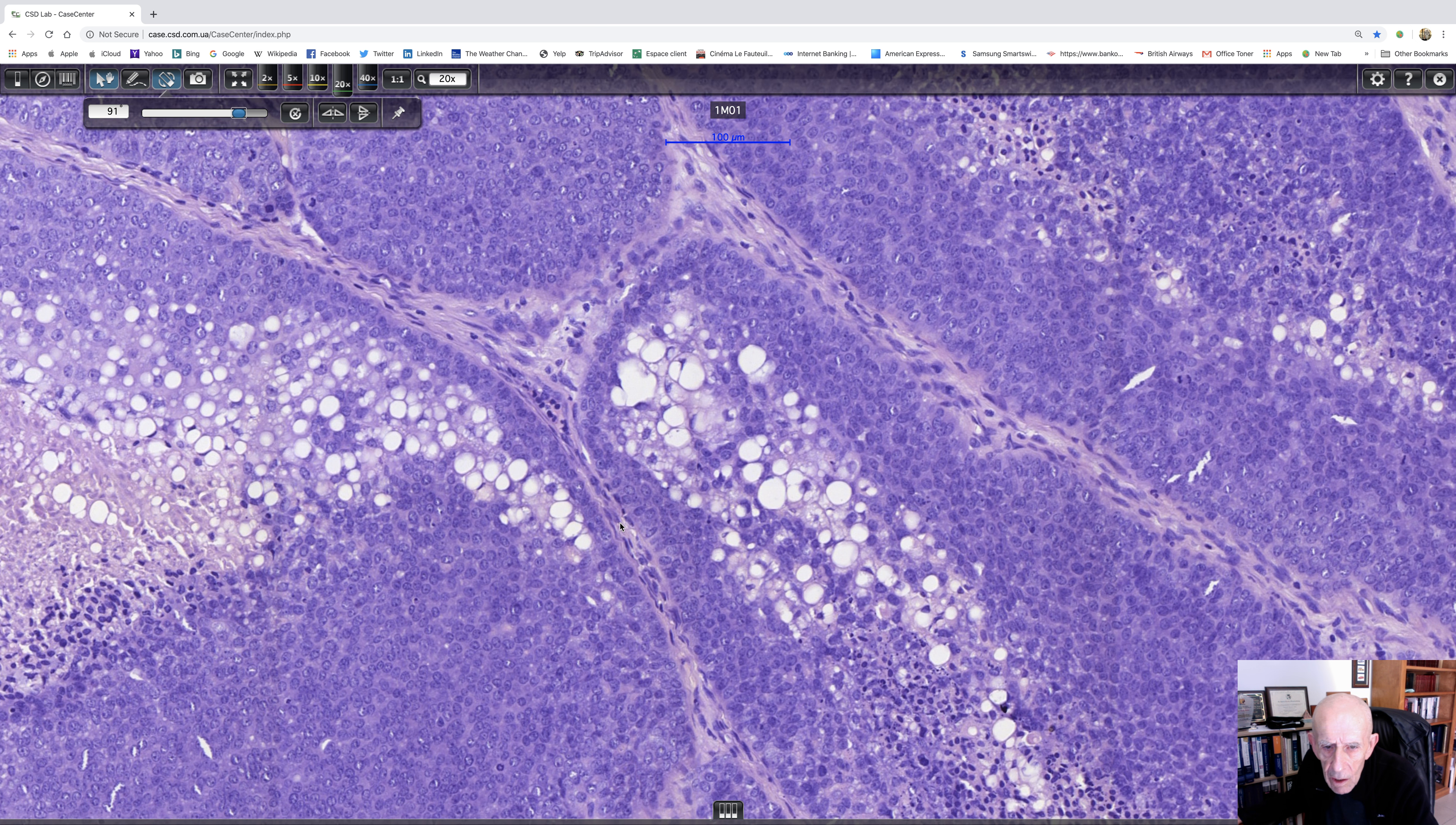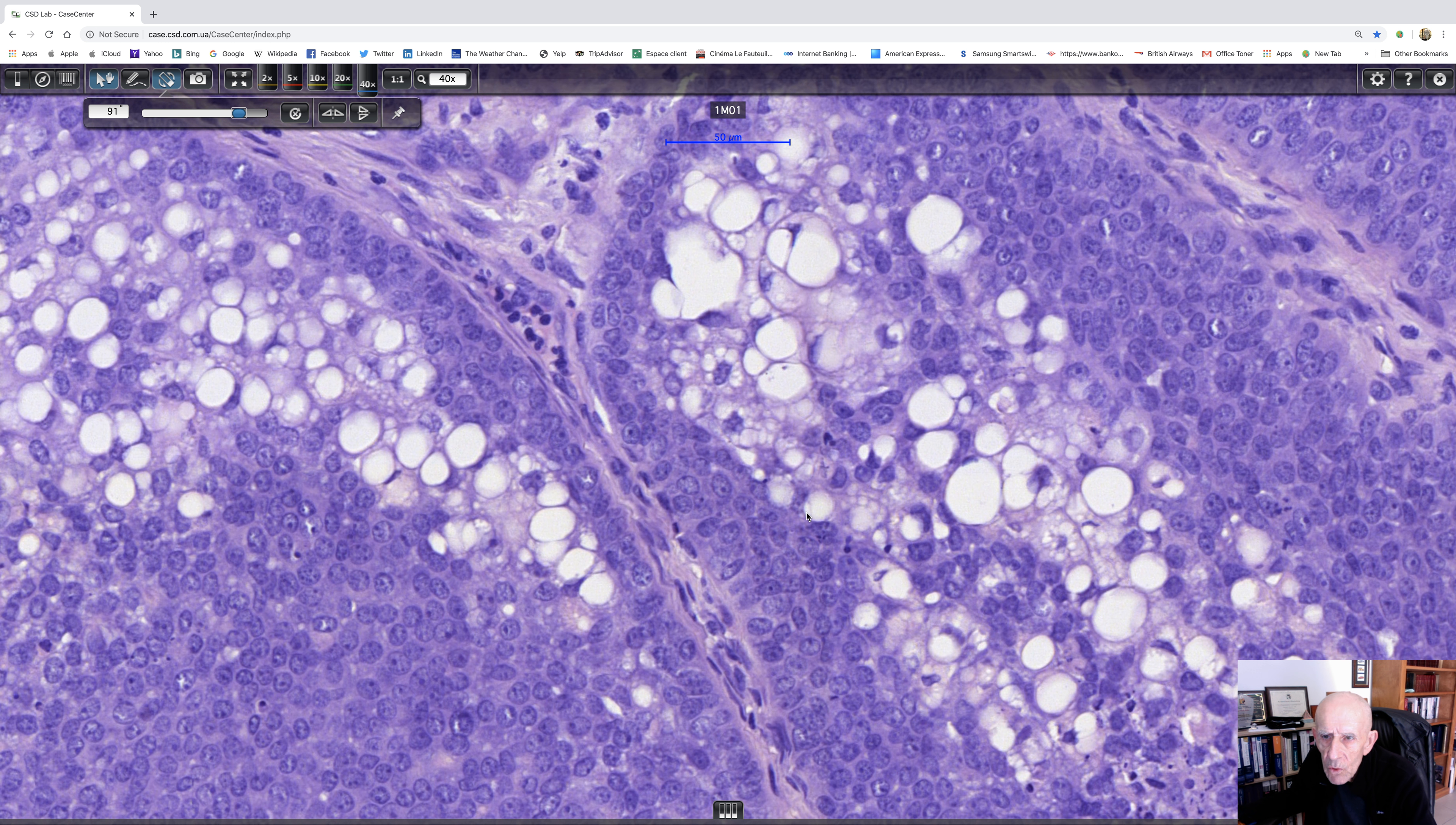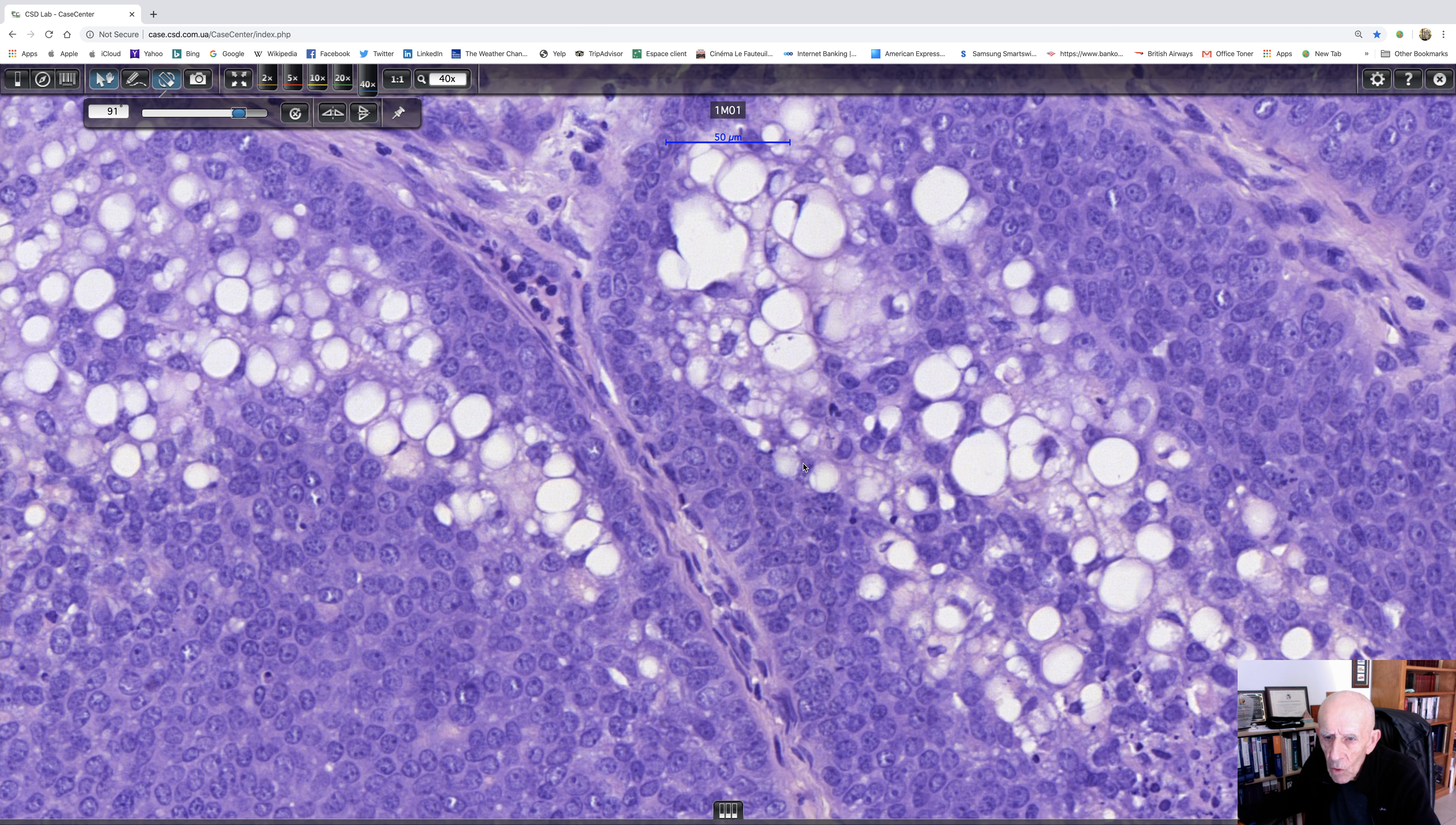Well look, there we are. We're absolutely in business. There is the most beautiful field there. And the diagnosis is now obvious. There is one of these cells. It's got multiple small round vacuoles, sort of indenting the nucleus in the middle. That is the nicest sebocyte you could ever want to see in a sebaceous carcinoma.